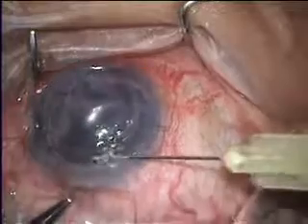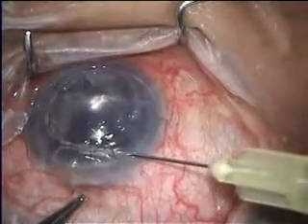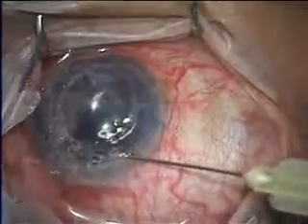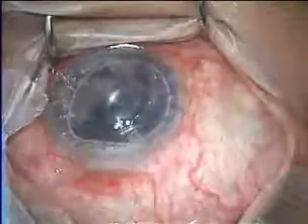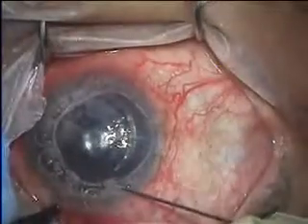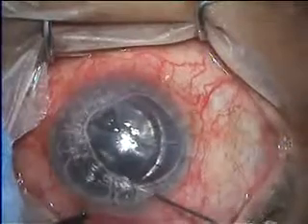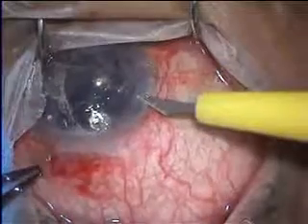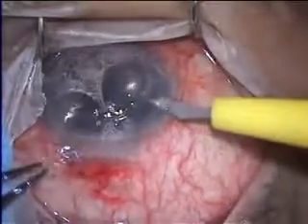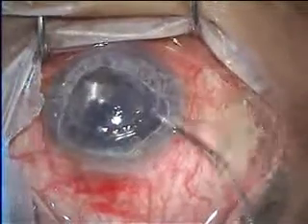To begin with, air injection was tried with 30 gauge needle. The interface was checked by asking the patient to look in different directions. Still, the air tamponade was not good in this case. So a small side port entry was made, and further air was injected through this port to achieve good tamponade.